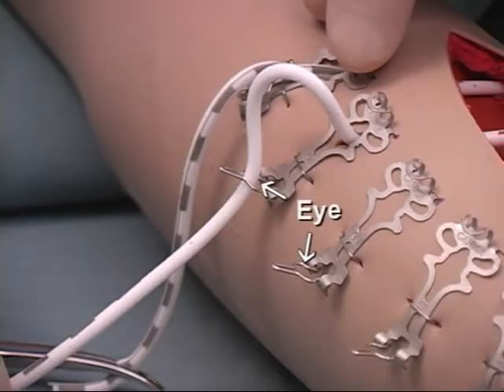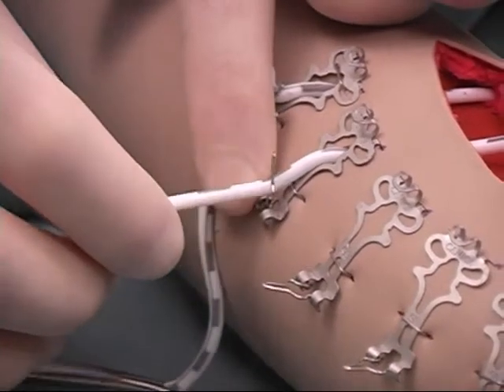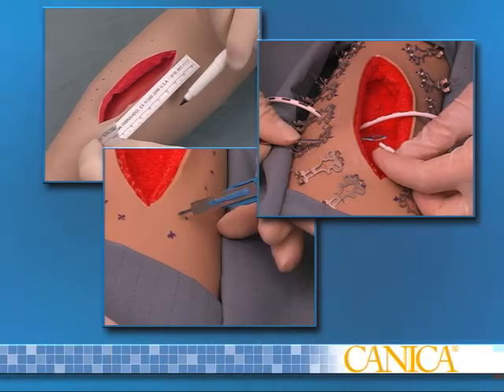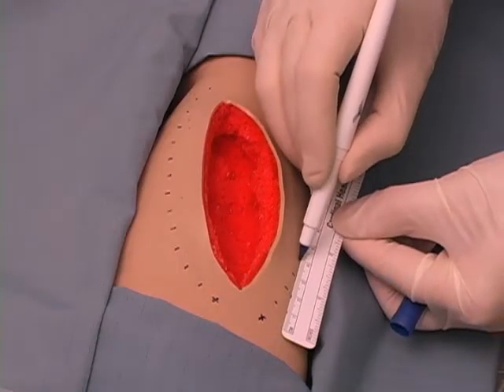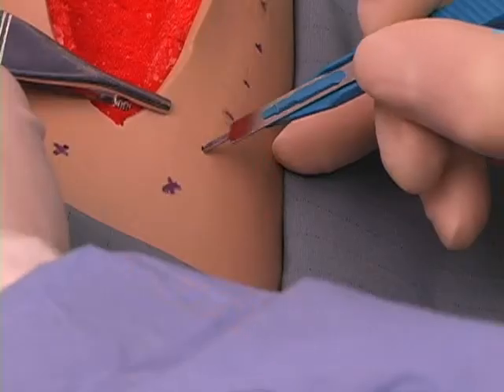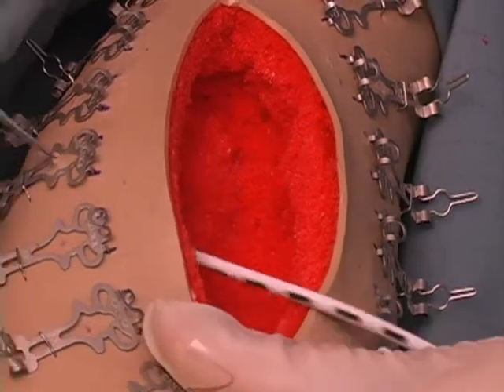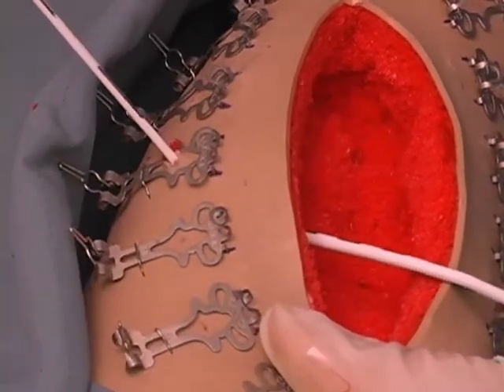The wire cleat has an eye that allows the elastomer to be captured at any point and released for wound management or to adjust tension. The set also includes installation aids, a ruler and skin marker for establishing the proper layout, a lancet for creating skin holes, and a loop cannulator to install the elastomers through the skin.